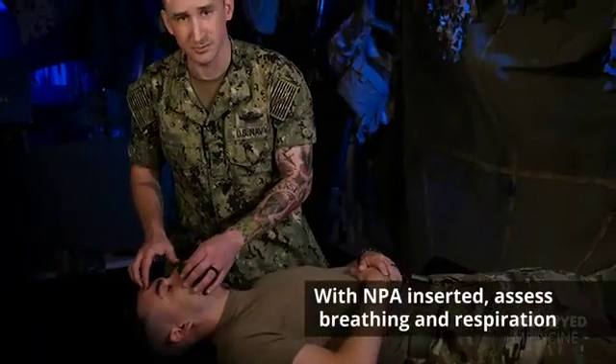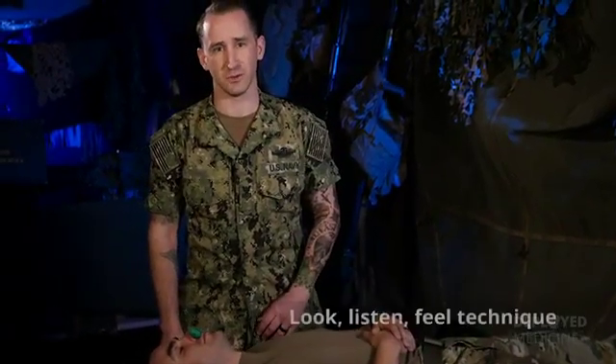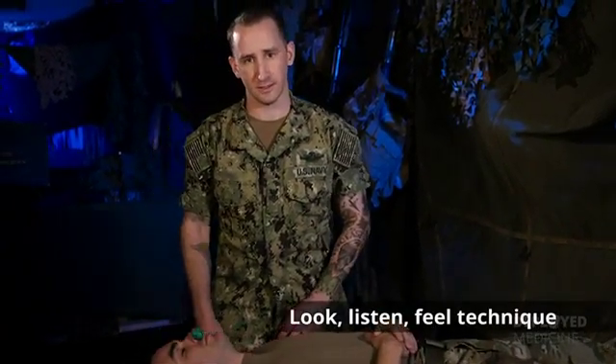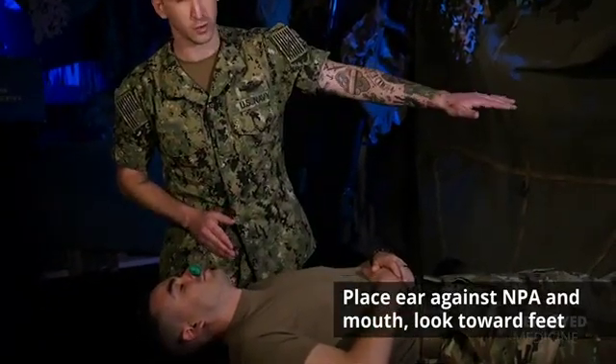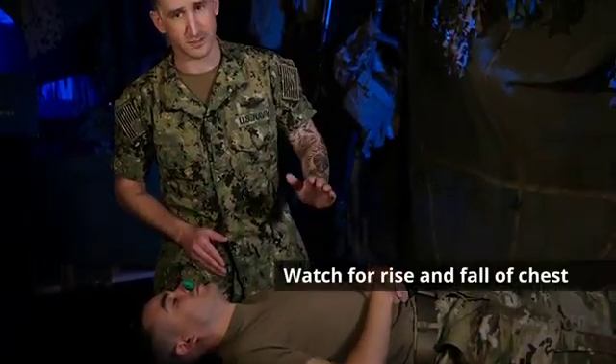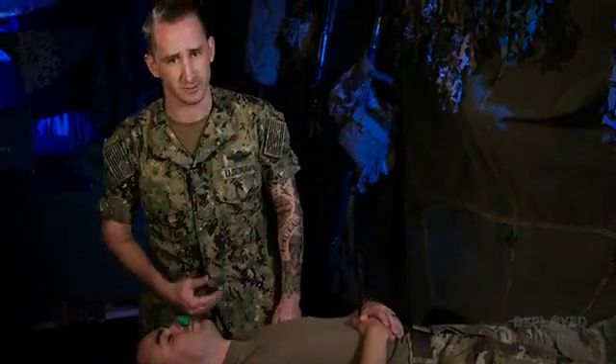After the NPA is properly inserted, you're going to want to assess your casualty's breathing and respiration. This is done using the look, listen, and feel technique. Place your ear against the NPA and the patient's mouth, look towards the feet watching for rise and fall of the chest, listen for breath sounds, and feel the breath against your cheek.